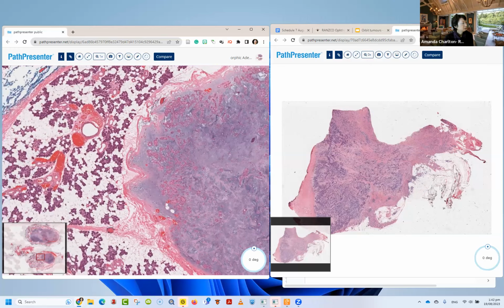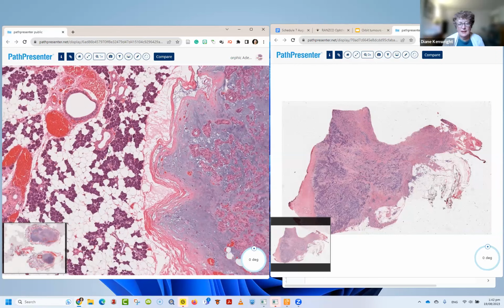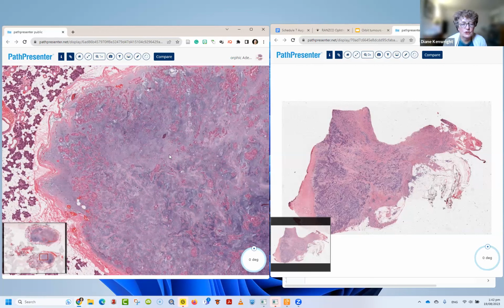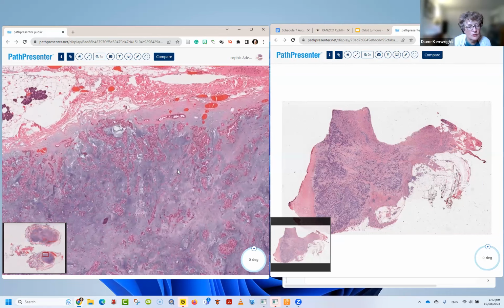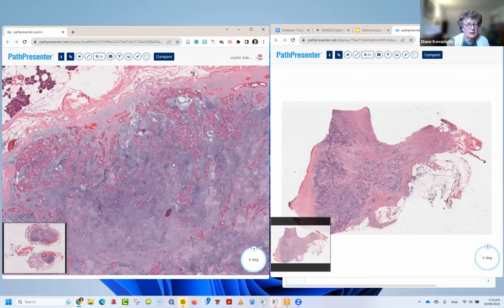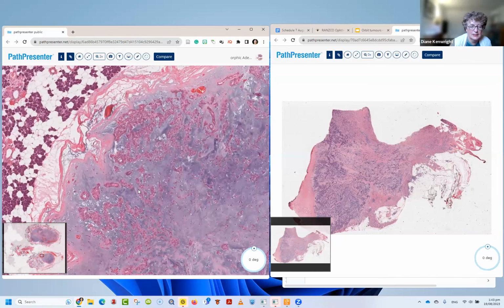What's our normal tissue? So the normal tissue to the left is actually salivary glands, because I chose this one because of the great stroma. And then to the right-hand side of that, we've got the bluey kind of stroma, but also the bright pink epithelial cells. Okay, so can we just, right at the left-hand edge of the tumor, we've got some nice ducts and some nice stroma. Can we zoom in there, please?